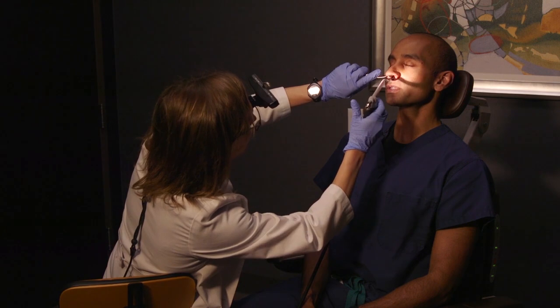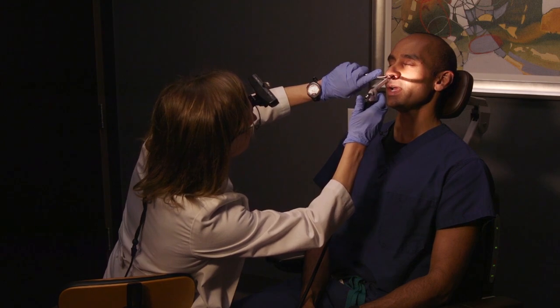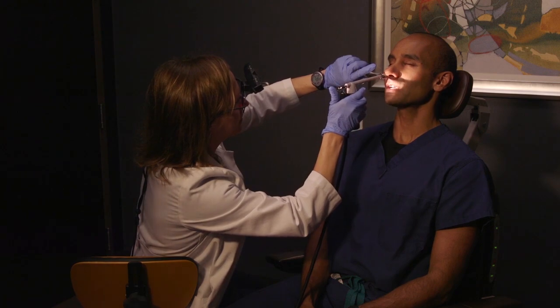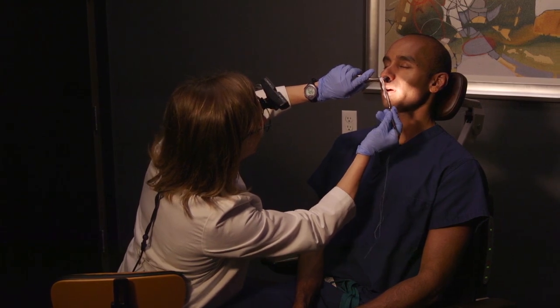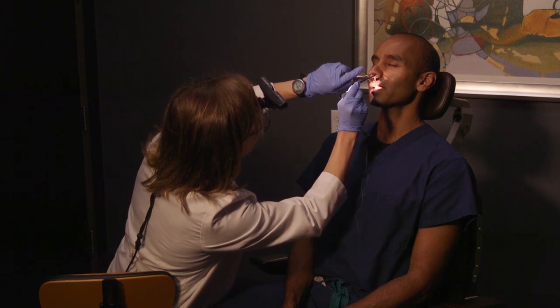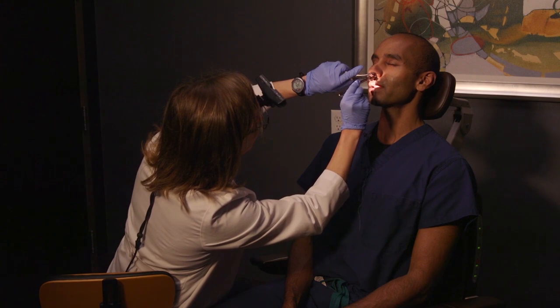Kristen is going to take a look at my nose and then spray a numbing medicine that helps to open things up and numb the surfaces. We're going to make sure we start the process right and get things going. Now we're sneaking the cotton balls in — these have a numbing medication and a decongestant medication, which will help to further prepare the surfaces on the inside of the nose.